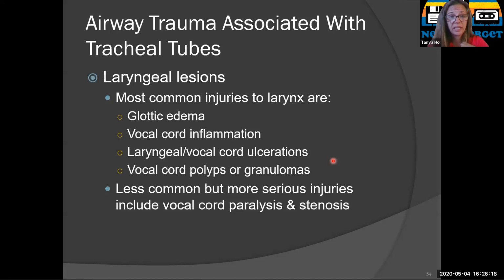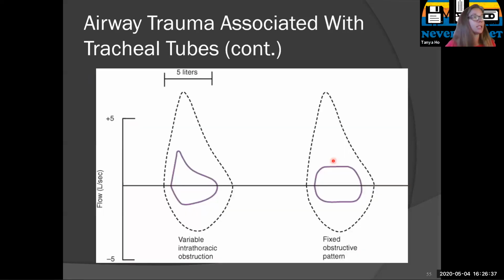are potential complications. This is the same slide as the tracheostomy tube because again, they're artificial airways. So all the same complications apply. The different one would be stoma. Like with endotracheal tube, you don't get the complications with the infection at the stoma site, but you can still get infection. Okay, this is flow volume loops. This one is your tracheal stenosis here.